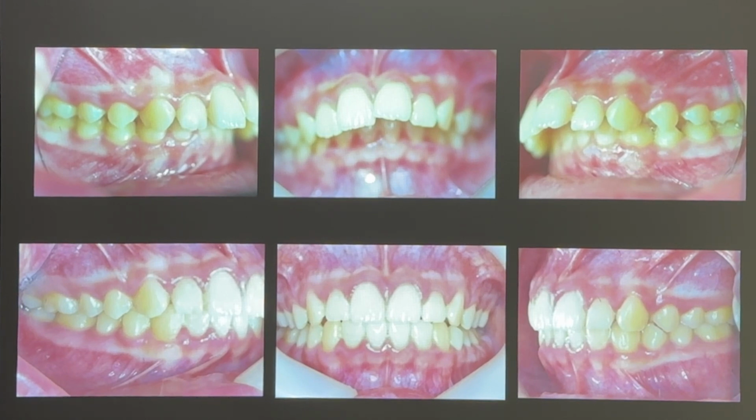And then I speak something. But if the patient is still okay, it means this patient has habitual mouth opening. Okay? So I check.